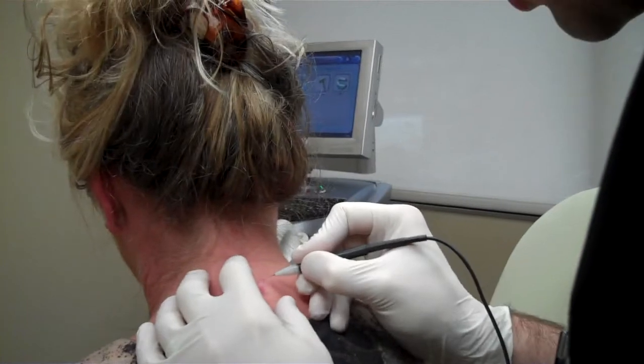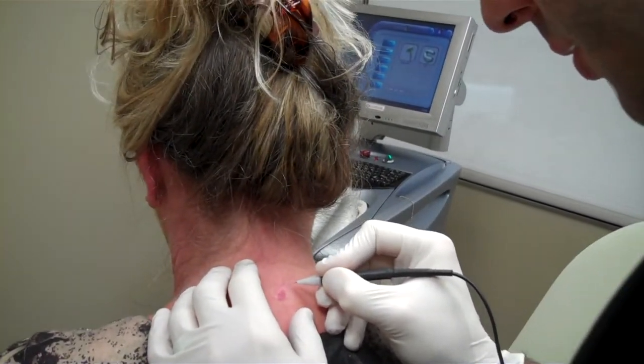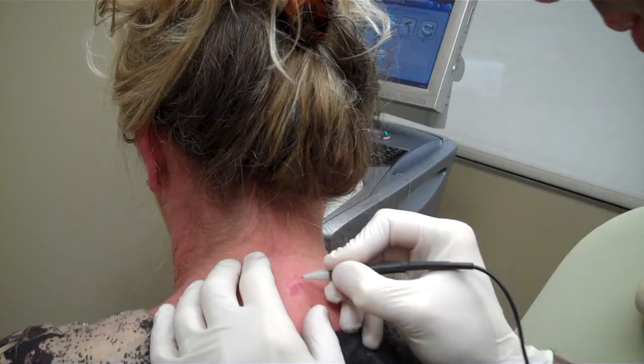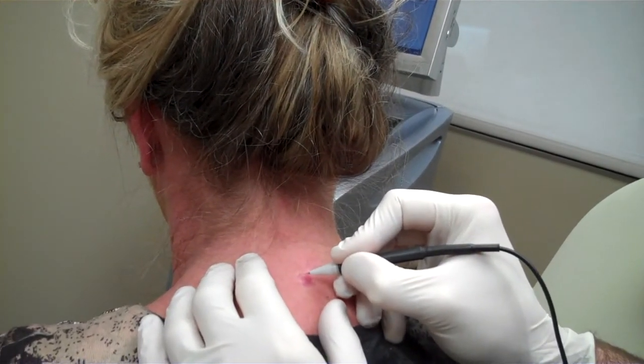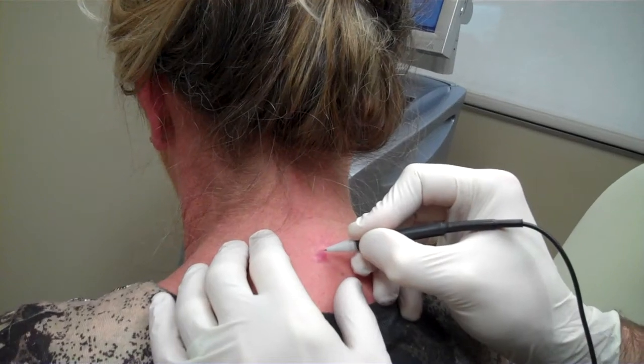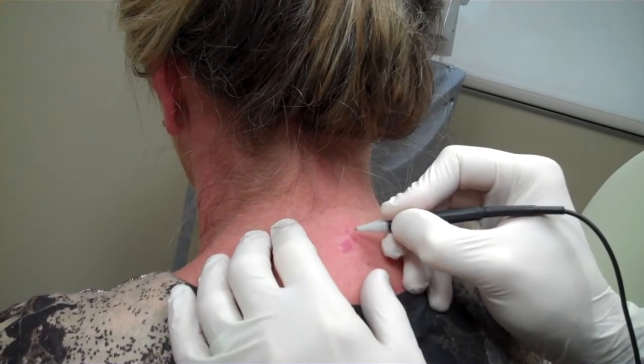Let me know if it bothers you. This is a great little treatment to do for spider veins but also for birthmarks. I don't know if you can really see it but this literally just will shut the vessels down right before your eyes.